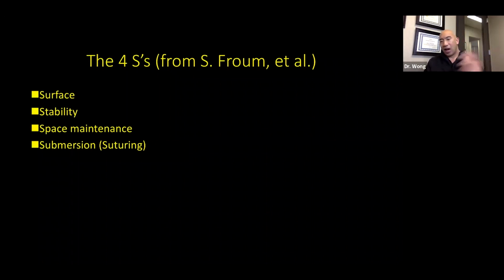So when it comes to extraction sites, you're not going to get bone growth if you have a pocket lining that we forgot to scrape out after we took out a periodontally diseased tooth. So we've got to make sure that the socket is free from a bunch of granulation tissue and granulomatous tissue and things like that.